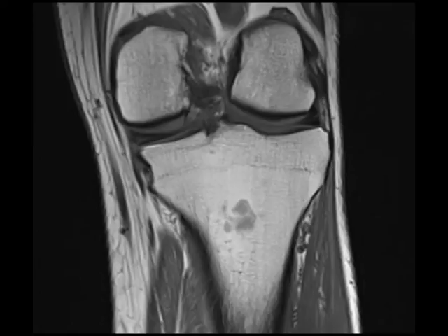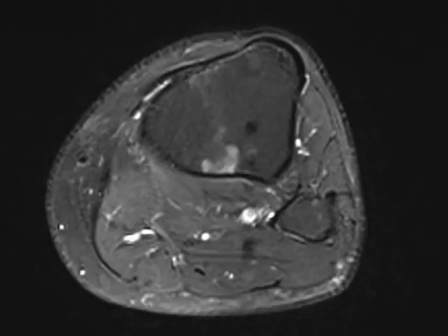This is a middle-aged female who underwent right knee MRI for evaluation of chronic right knee pain. There is an incidentally discovered rounded T1 iso-intense to skeletal muscle, STIR hyper-intense, non-diffusion-restricting, mildly enhancing lesion abutting the posterior cortical margin of the proximal right tibial metaphysis.